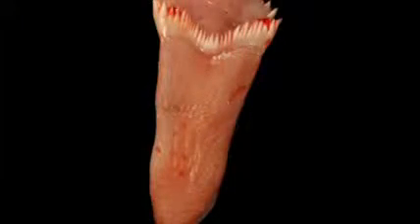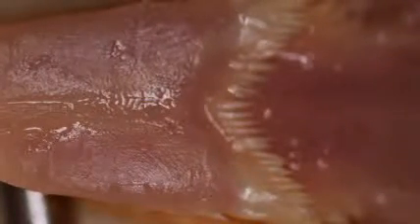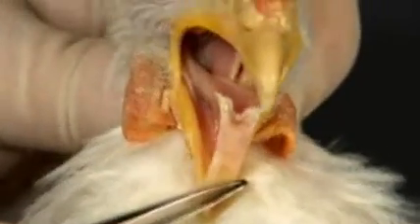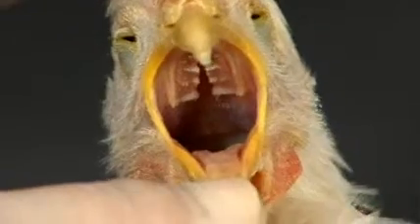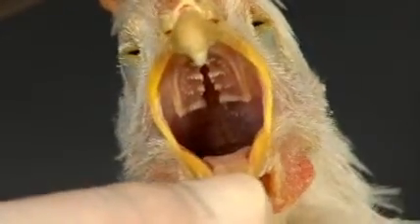A bird's tongue is supported by the hyobranchial apparatus, making it somewhat inflexible. The dorsal surface of a chicken's tongue is smooth, and there is a row of large papillae near its caudal attachment. Inspect the tongue for any lesions, such as ulcers or nodules. Inspect the oropharynx for any lesions.